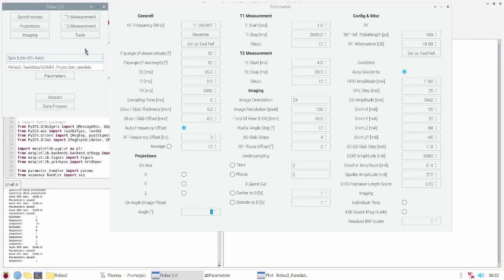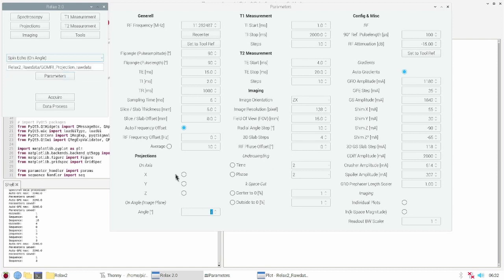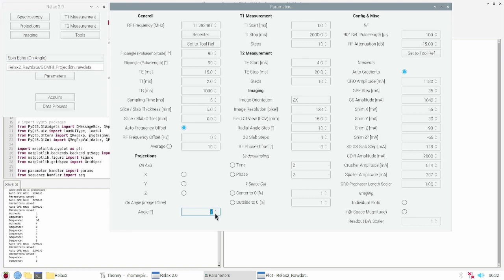It's also possible to acquire projections in an arbitrary angle. Just choose spin echo projection on angle and insert the angle in the parameters window.